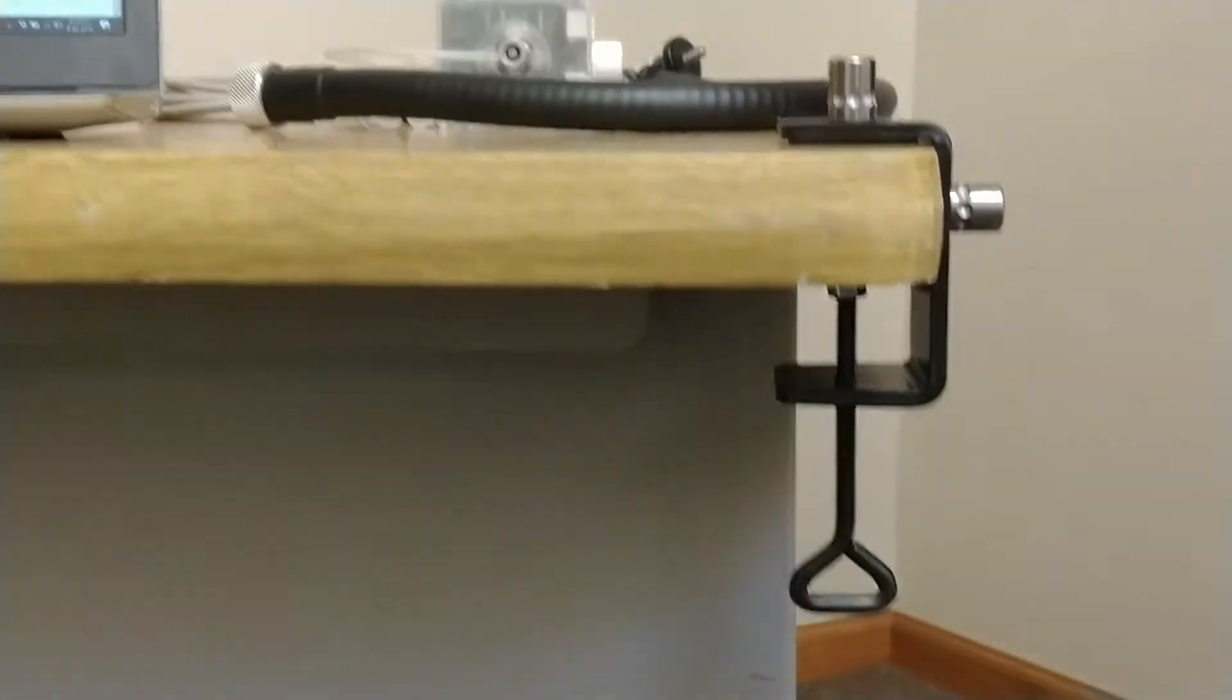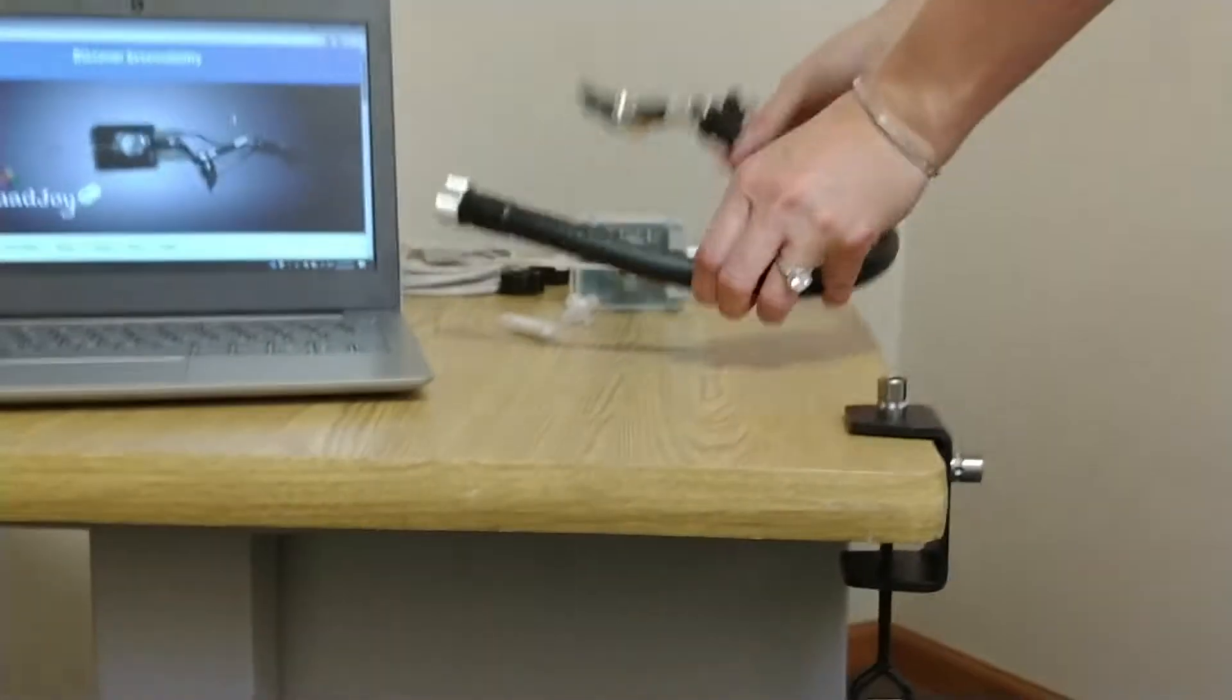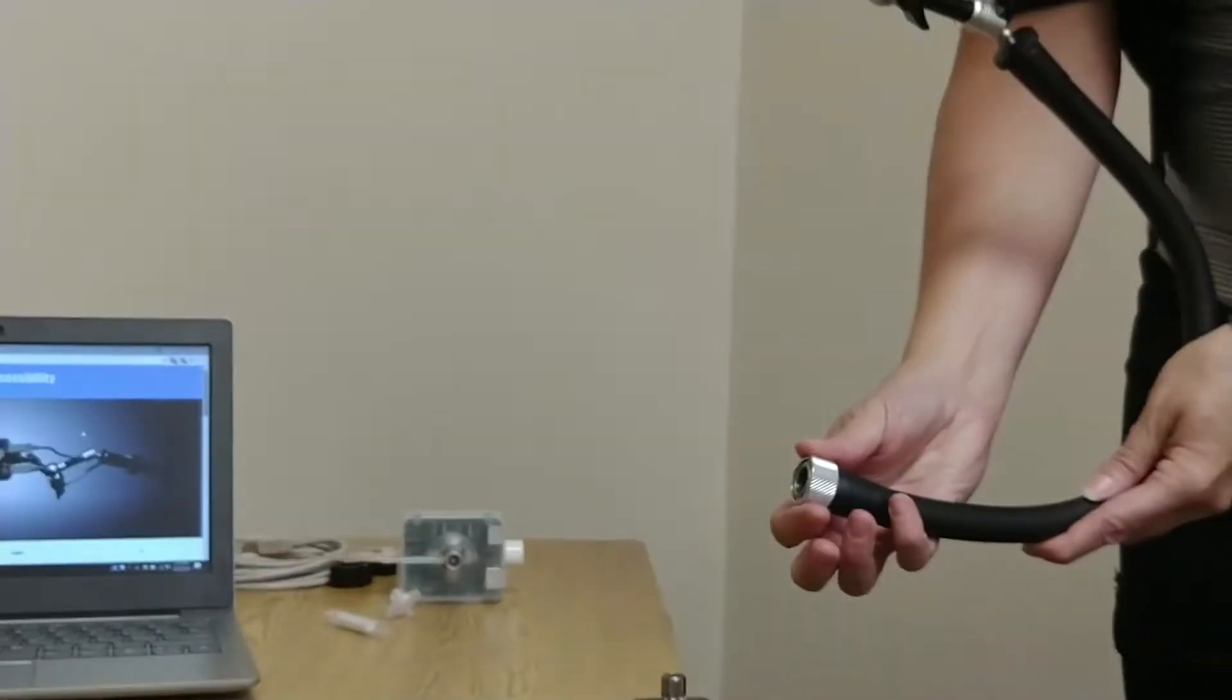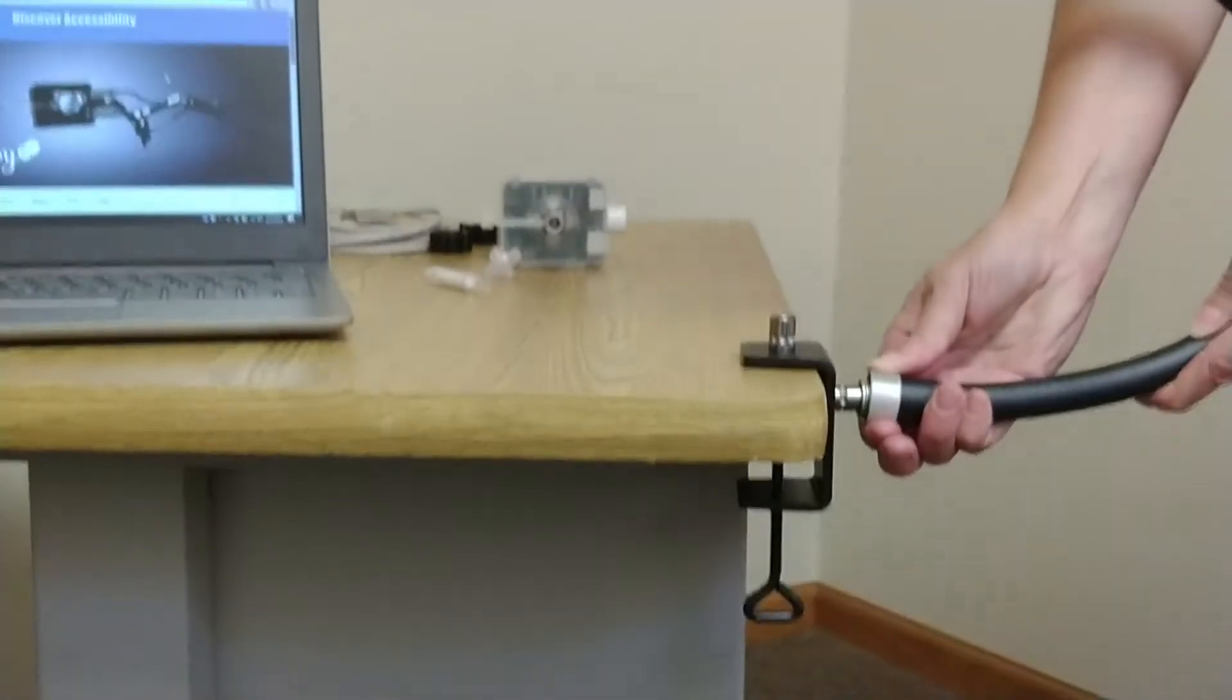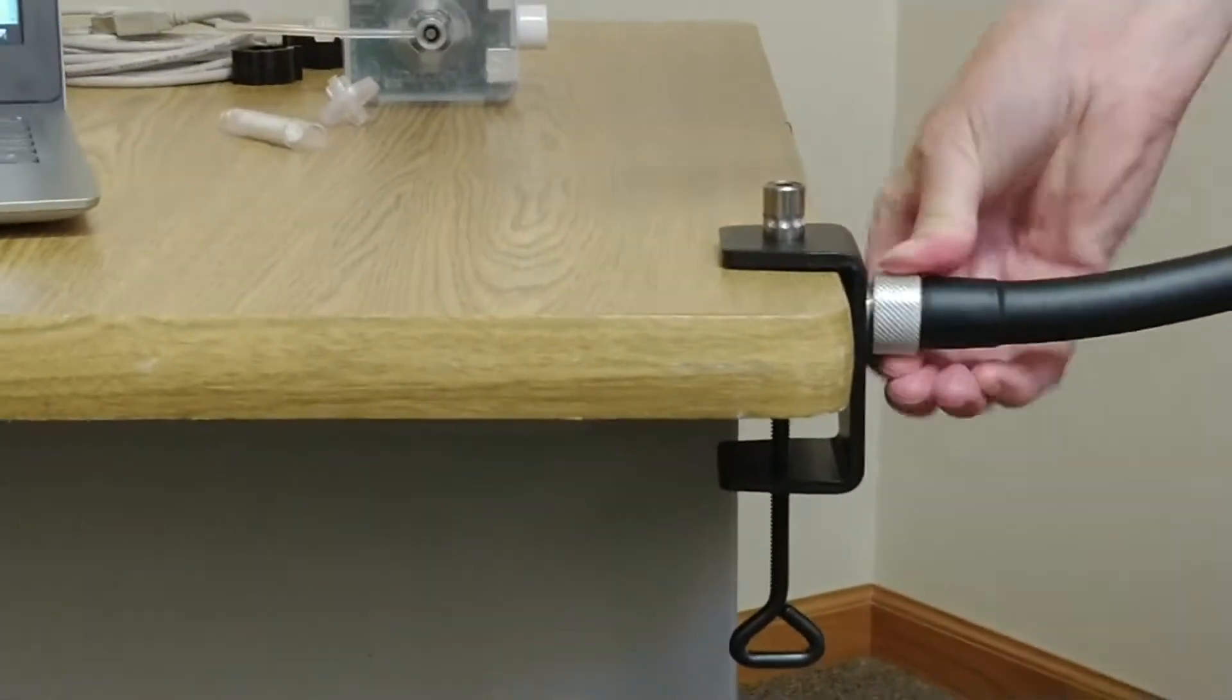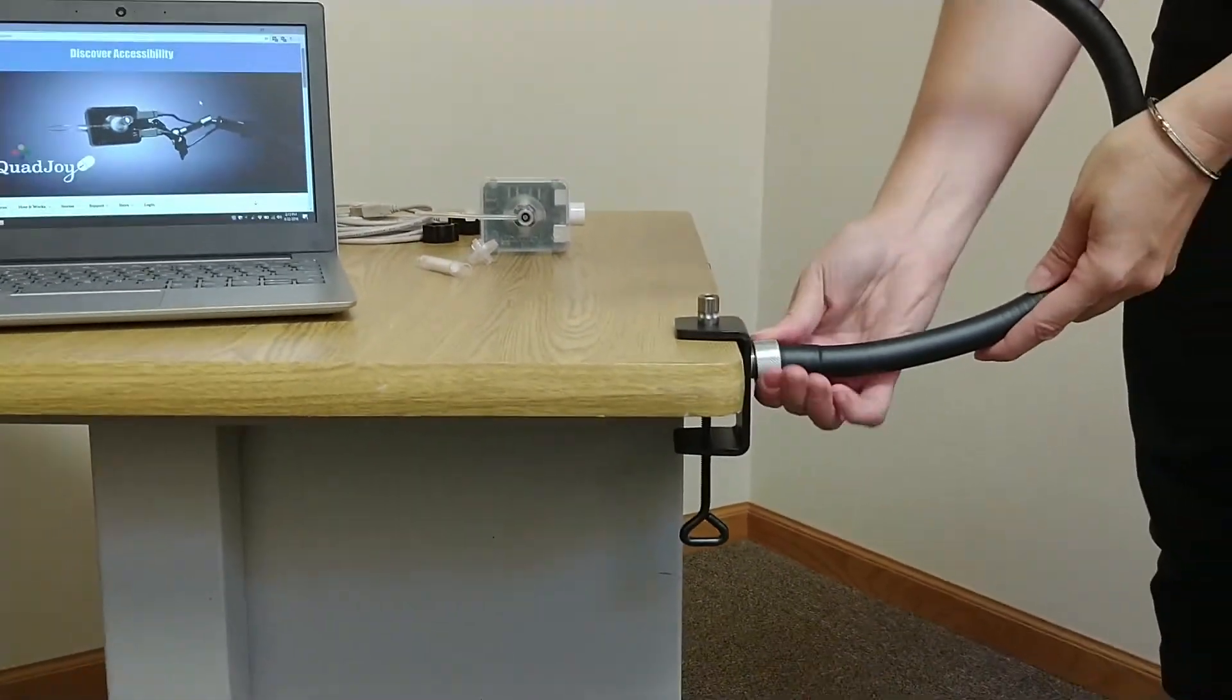Next, grab your flexible mounting arm, pull back the ring, and release to connect it to the clamp's quick connection stub.